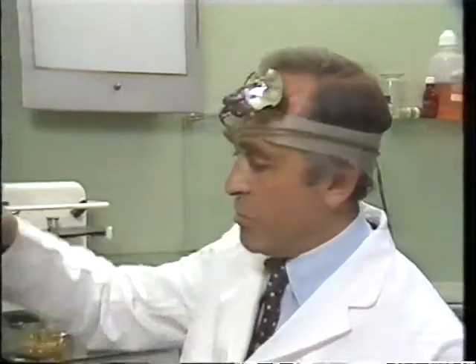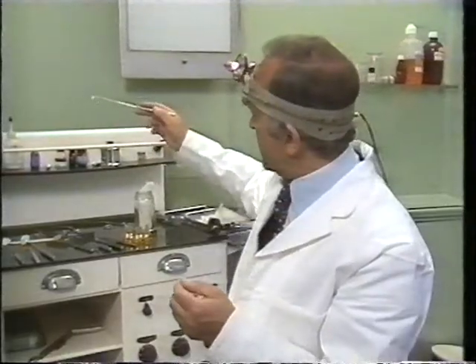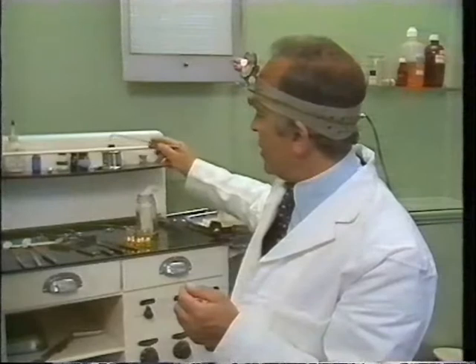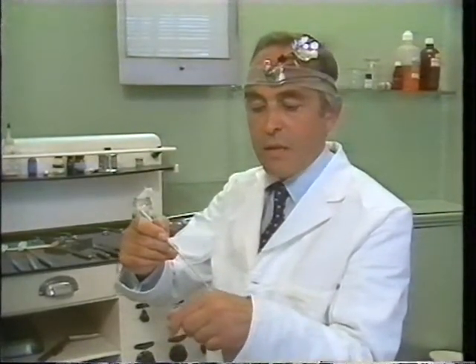Immediately above the oropharynx is the postnasal space. This is a very difficult area to examine and even in skilled hands, it is not always possible to obtain a good view. Because the area to be viewed is around a corner, a mirror 10 to 12 millimeters in diameter must be used. First of all, it is warmed by holding over the flame of the spirit lamp with the glass side down, and then the temperature is carefully tested against the hand.